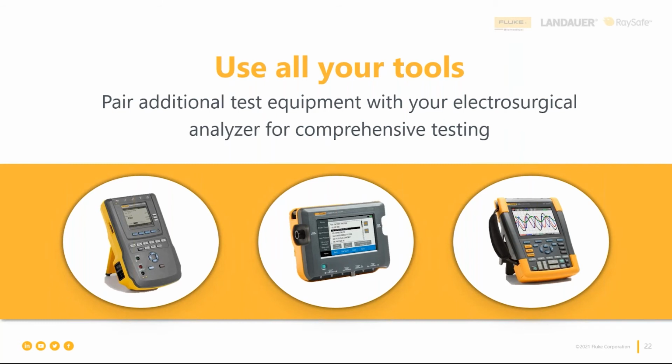So electrical safety analyzers, right? We have high frequency leakage, but we also have low frequency electrical safety and applied part leakage. So keep an electrical safety analyzer close by to complete the electrical safety portion of your preventive maintenance procedure. The other thing Justin brought up earlier, a medical oscilloscope. These can be used to show the actual wave shape of a device under test. And this waveform can be compared to the DUT's service manual and visualized by plugging the oscilloscope into the back of the QAS3. Then the last one was what we just had in the poll question, argon, right?